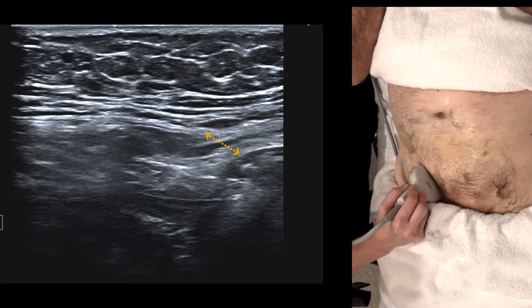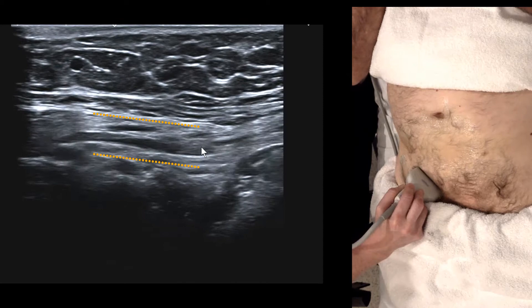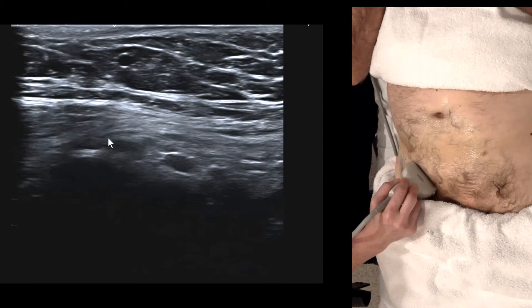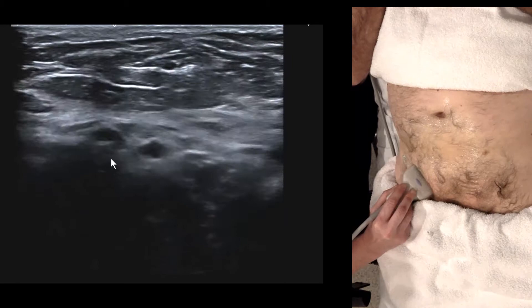Measure the superficial ring obliquely from here to here. Then rotate the top of the camera to point to the ASIS and fall onto the pampiniform veins, which we follow up to the deep ring. We see an angulation where they dive into the abdomen - at this point take the camera about a centimeter more lateral, lay it flat, and by coming in from the side we can clean up the deep ring and see it nice and clearly.